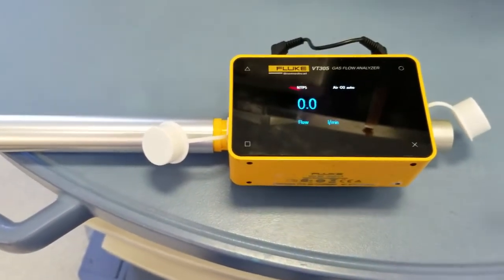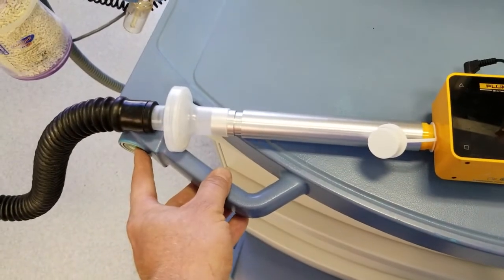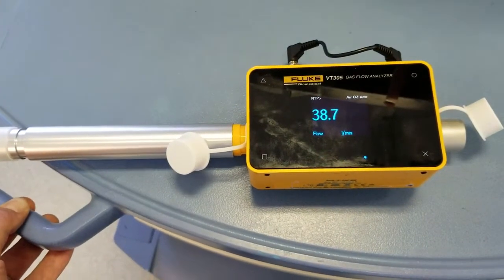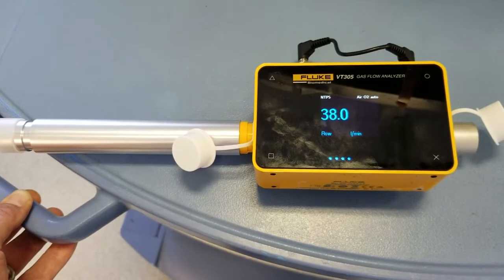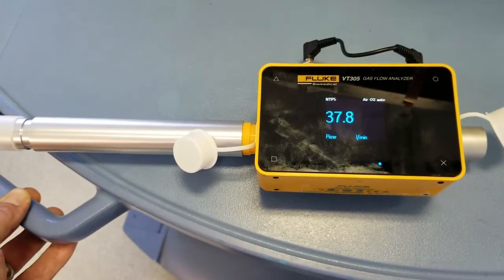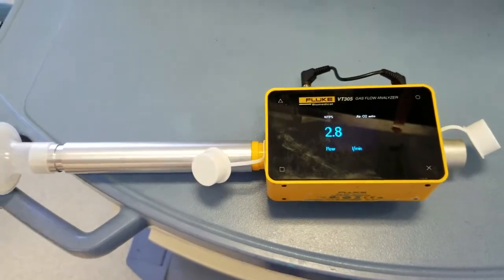We'll hit the square button and bring up the flow in liters per minute. I'm going to depress the O2 — that's my flush valve — so I'm flushing at 38.0 liters a minute. Then I'll let go of that and we'll do a mixed gas test.